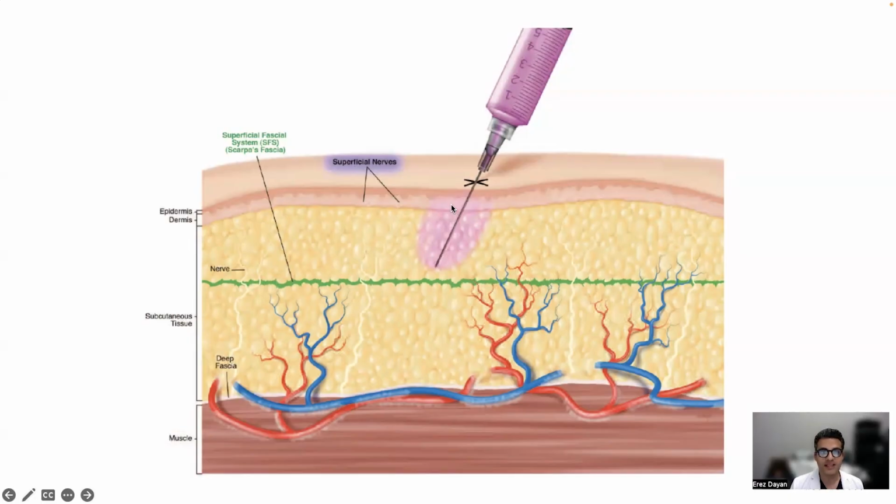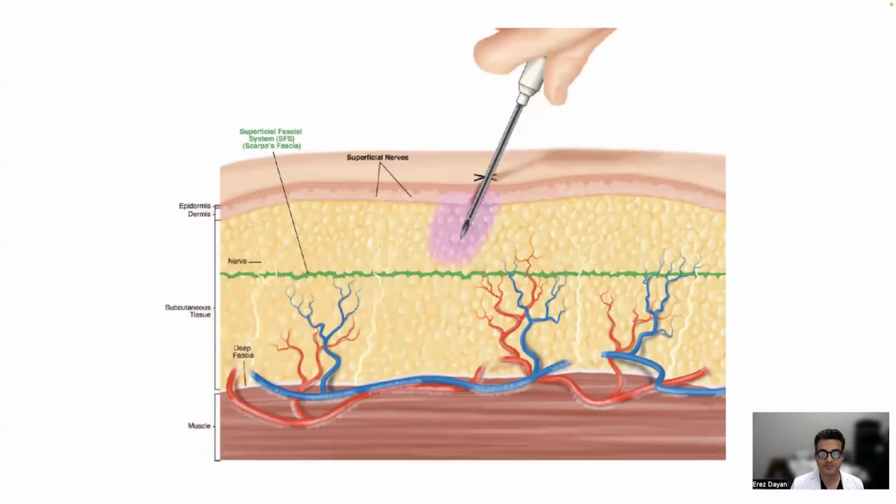You don't even want to see any skin changes from your initial local anesthetic. So inject the 10 cc of 1% lidocaine with epi directly in the subcutaneous space. Oftentimes I'll just go straight perpendicular under the skin into the subcutaneous space. Each access point can get anywhere from 3 to 5 to 7 cc's of 1% lidocaine with epi.